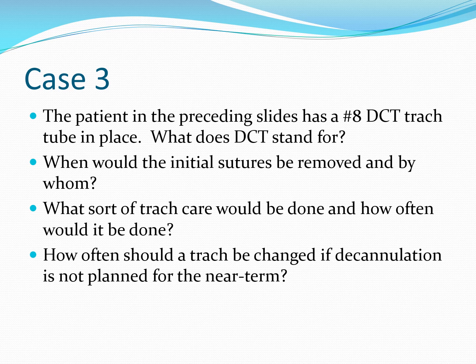And again, there's a little bit of variation from that. It could be every 2 weeks, but typically around every month. So when you have a trach patient, these are things you should pay attention to. If it hasn't been changed for 6 weeks, it should be brought to people's attention. If the patient's getting transferred out, and let's say it's been 3 weeks, maybe it's a good idea.